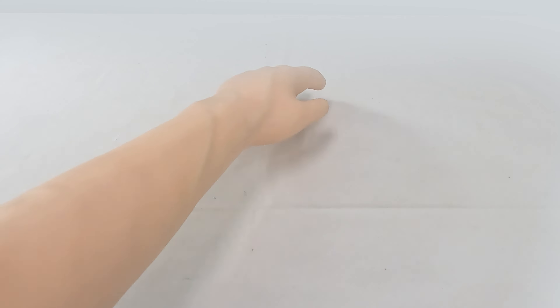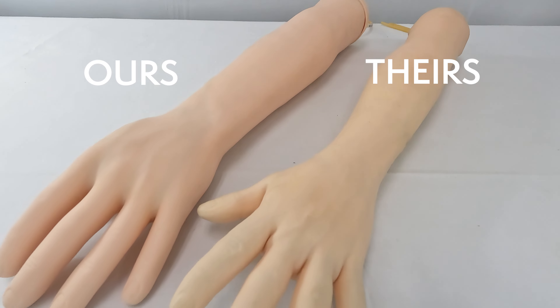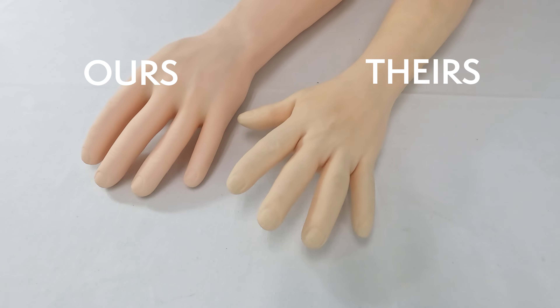To demonstrate the superior quality of this arm, let's compare the appearance, accuracy, longevity, and value of the Anatomy Lab IV arm to other brands sold online. Starting with anatomical accuracy, the quality of the skin, vein placement, and proportionality of the arm are noticeably different when comparing the arm to another brand.